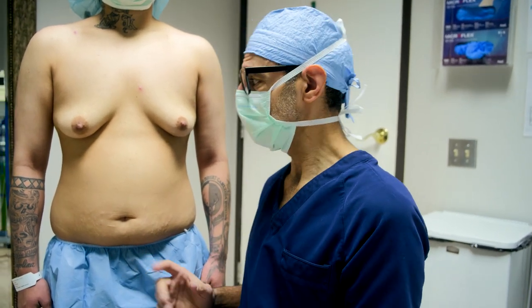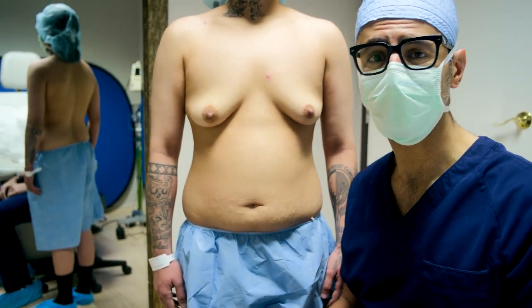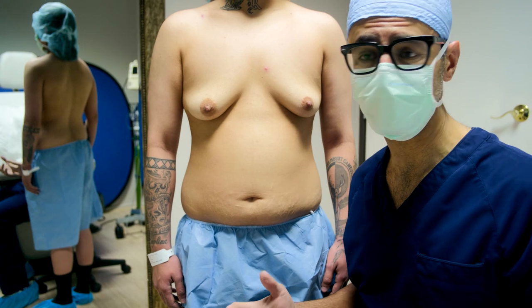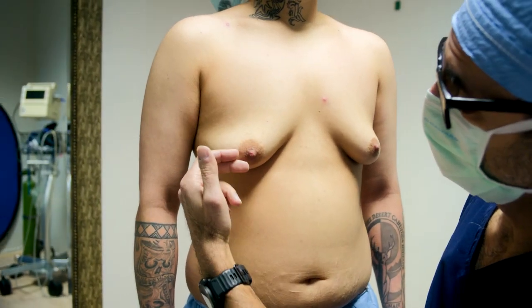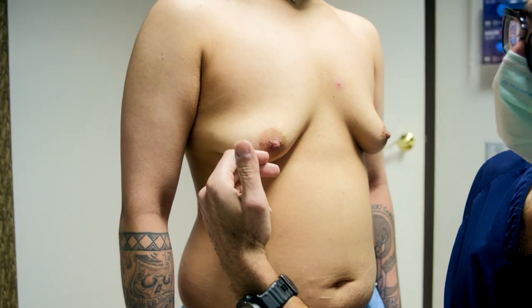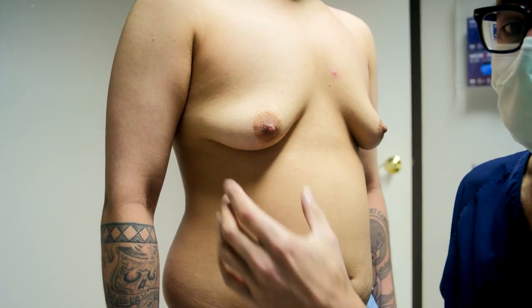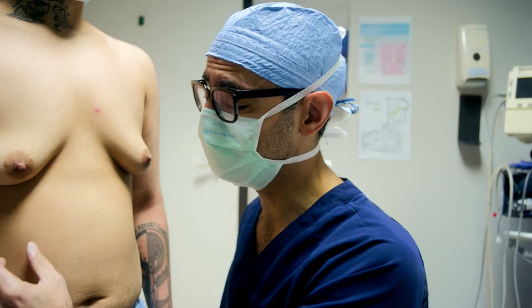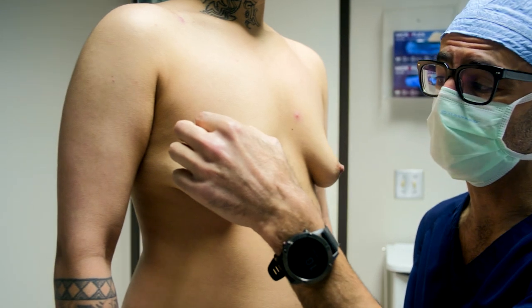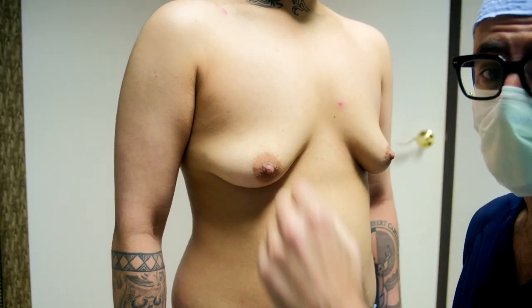This patient is going to need a double mastectomy with a free nipple and a free areola graft. The reason for the double mastectomy is because there's just too much extra skin and the areola nipples are too low on the chest to just do it through a keyhole or periareolar incision. So in order to make the chest contour more masculine, tighten up the skin, and place the areola nipples in the right position, I have to do what's called a double incision with the free graft.